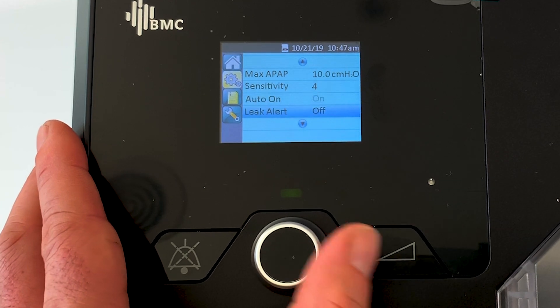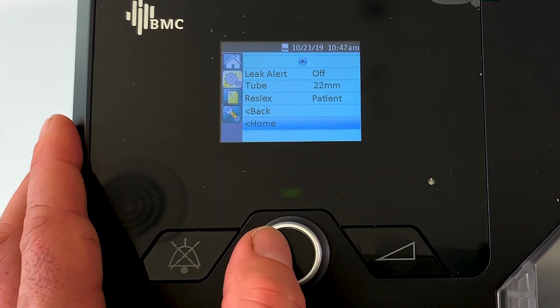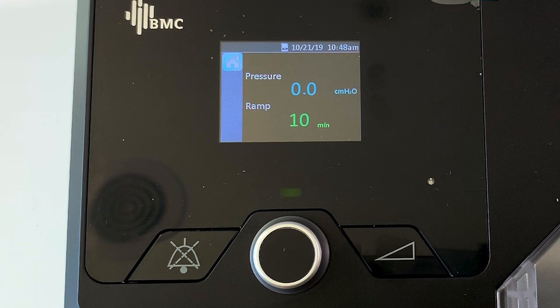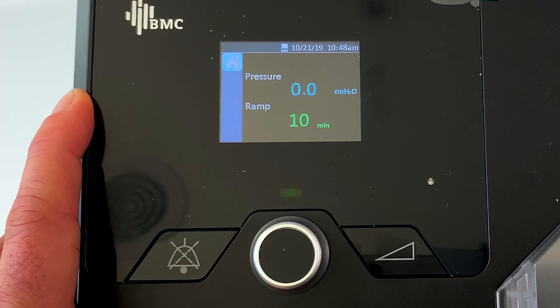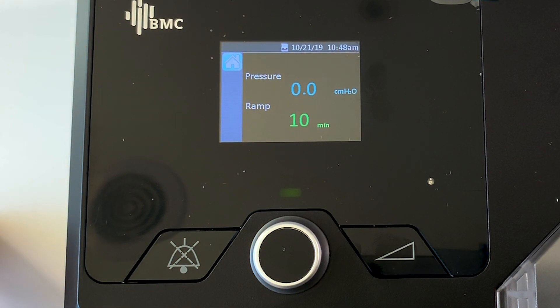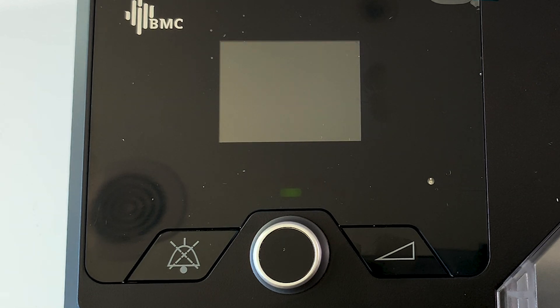Lock that in, go back down to home. What that means now is the machine only has the ability to go up to 10. We know from the data that to treat 95% of your sleep apnea, the machine was at 10 or under. So by having the maximum pressure at 10, we're still able to treat 95% of the sleep apnea you're having, without the pressure going too high and waking you up and disturbing your sleep.